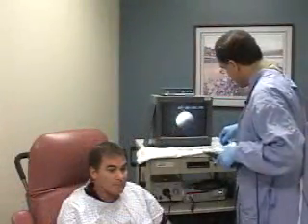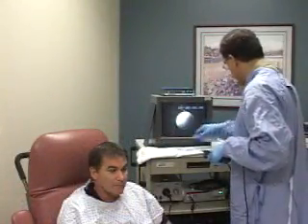Most importantly, it can determine whether aspiration or penetration exists. It also can tell us about the presence or absence of hypopharyngeal residue. In some cases, one may be able to test premature oral spill into the pharynx. But the main utility of this technique is to define the safety of swallowing, i.e., if there is aspiration, then we have our answer.